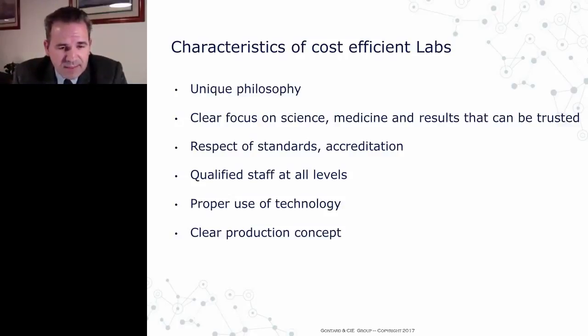We're not against multiple vendor platforms. Actually, we operate only multiple vendor platforms. We don't have a single platform that is a single vendor. And instead of doing a vertical production concept, we do horizontal, where we give each family of assays to one producer or one supplier, and the next potentially to another one.